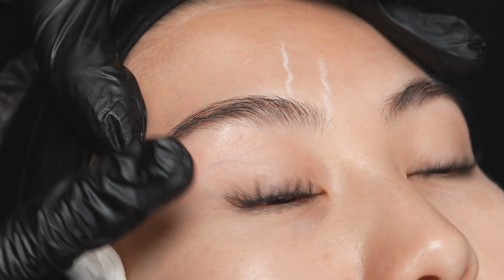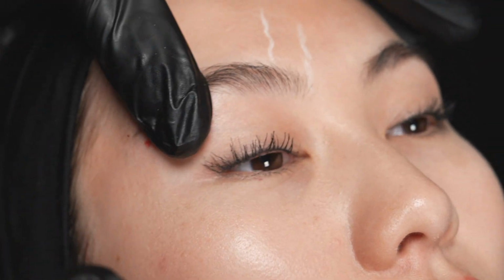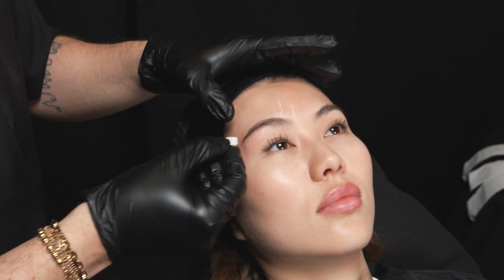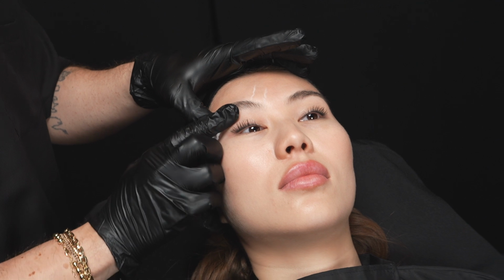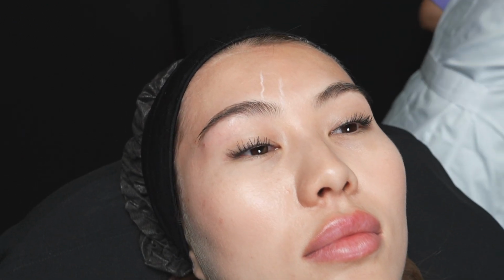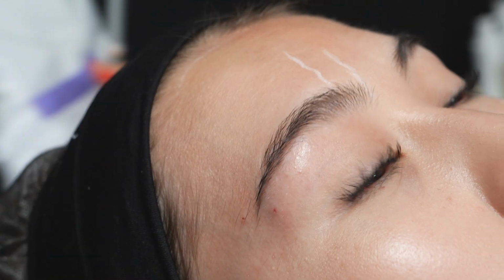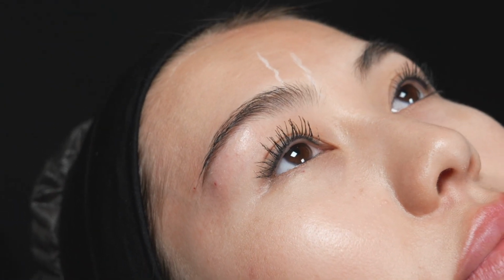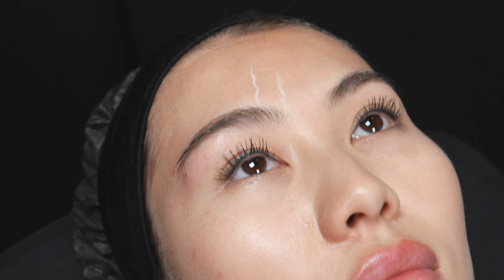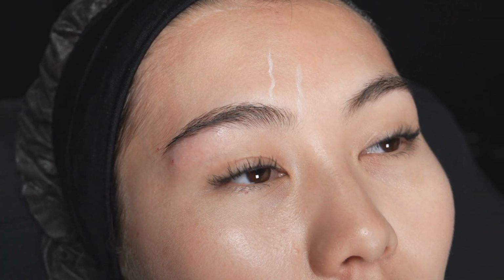Чуть-чуть нажимаю, расправляю продукт, который я ввел в эту область. Аккуратно расправляю. И давайте посмотрим на эффект. Сейчас еще немножечко надо будет нажать. Да, посмотрите, эффект визуализируется или нет. Чуть-чуть, да, у нас лифтинг-эффект пошел, видите? Я не хочу слишком много вводить продукта.